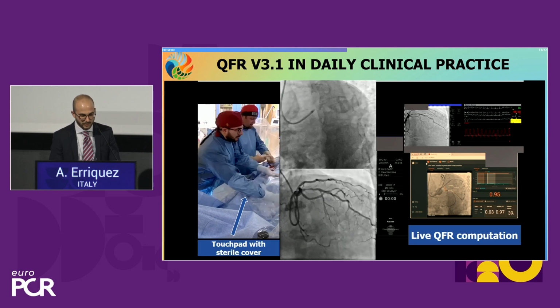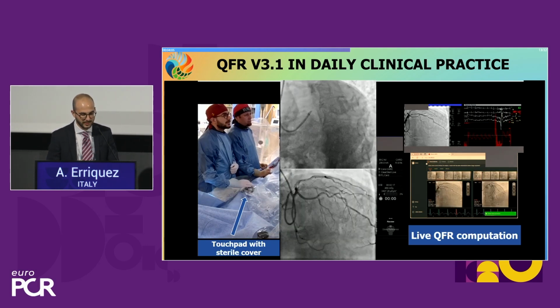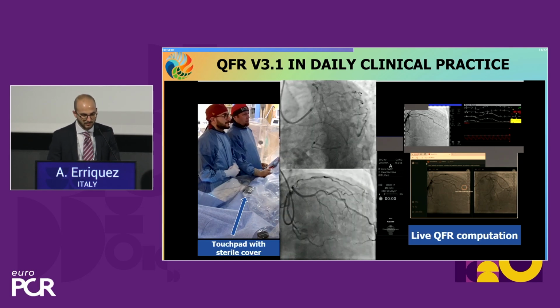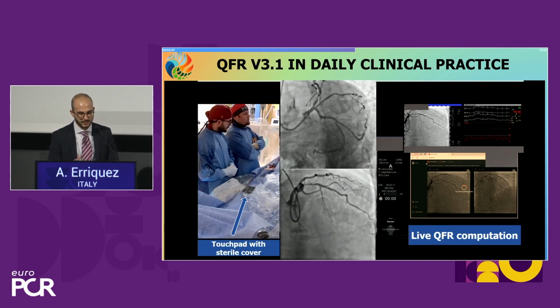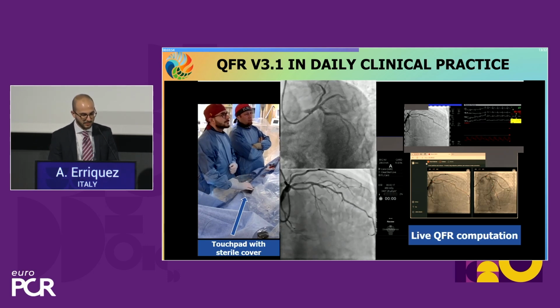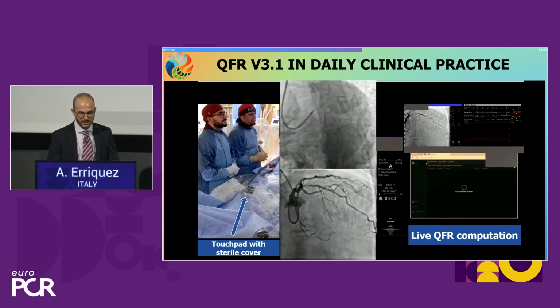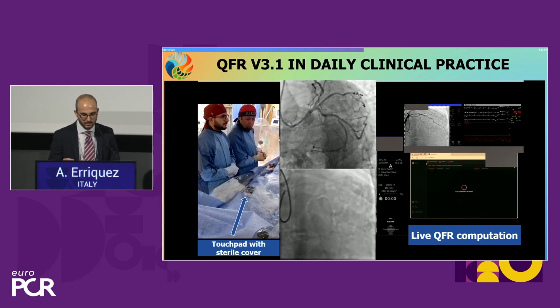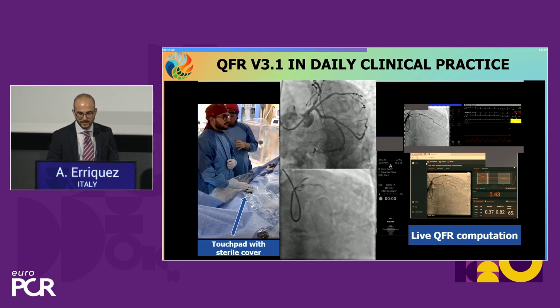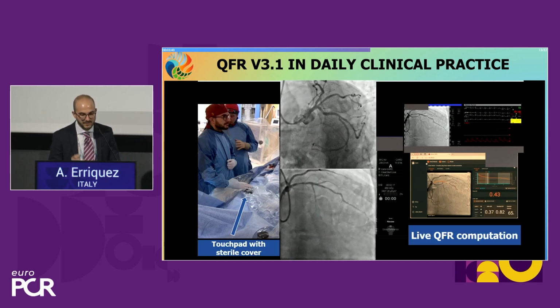In this case it was performed by myself and my professor Gianluca Campo, as you can see on the left of the slide, in a patient with chronic coronary syndrome and intermediate lesions on both the circ and LAD. Thanks to a portable touchpad with Bluetooth connection and a sterile cover, we were able to perform the computation in real time, as you can see on the right of the screen, on both vessels in very few steps and in very few minutes.